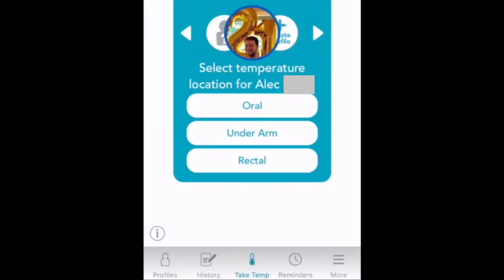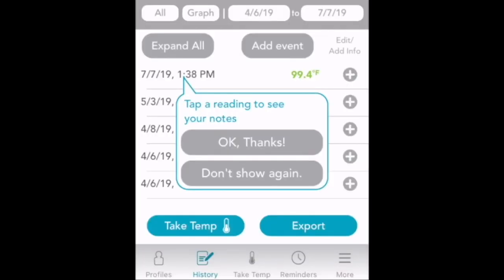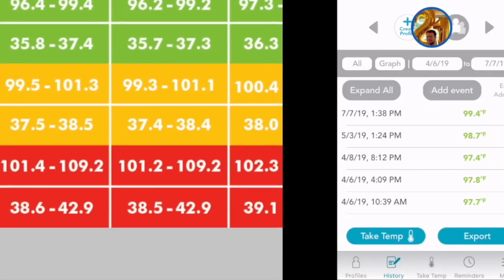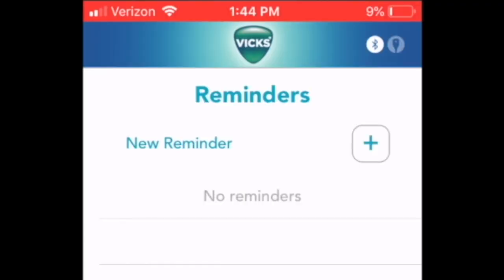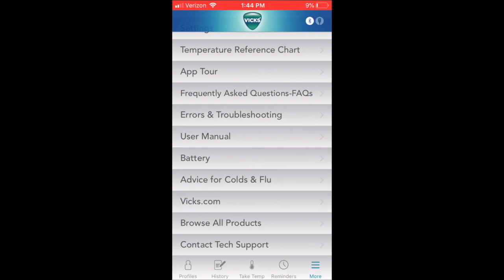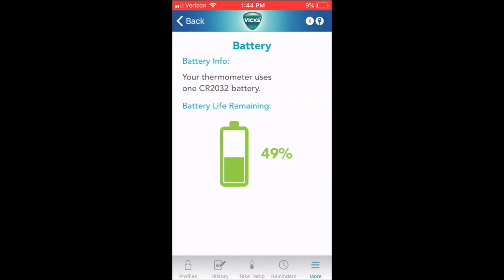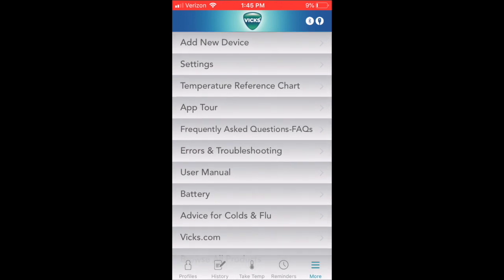Here is the app — I just opened the VIX. It shows profiles, and right there is Alec. You can see the history of the few times I checked and had a normal body temperature. But today I checked and it says I have a low-grade fever. There are also reminders — useful if you're sick with the flu. I can check the battery: you can see the Bluetooth icon came on, and it says 49 percent battery remaining. You can also see all the products, the manual, and the app tour.